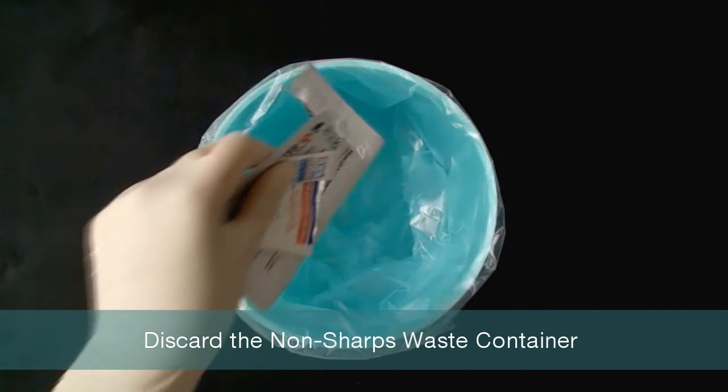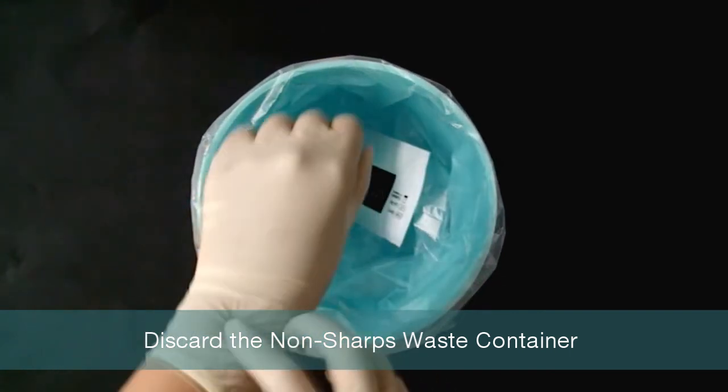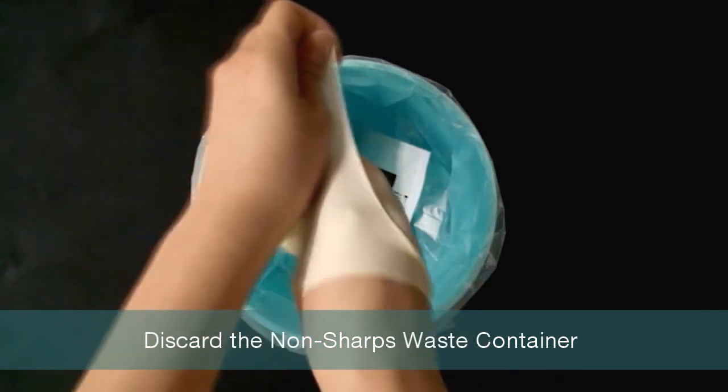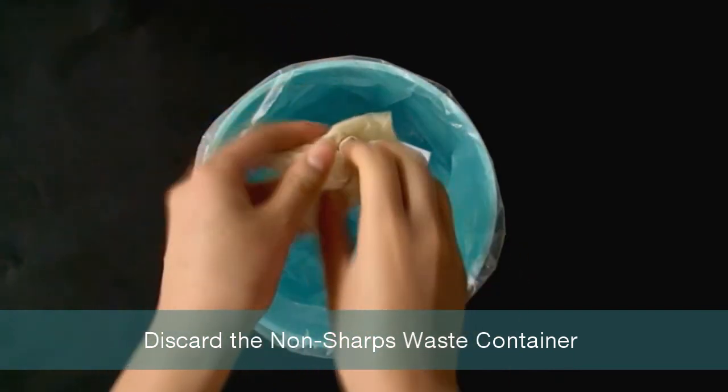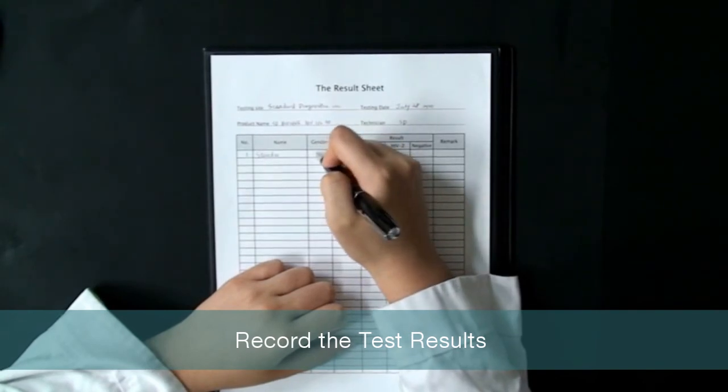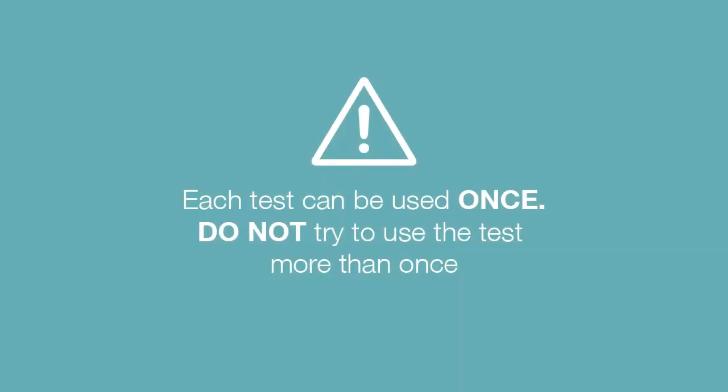Dispose of test materials such as the test device, gloves, alcohol swab, desiccant, and packaging in a non-sharps waste container. Record the test results. Remember, each test can be used only once — do not try to use the test more than once.